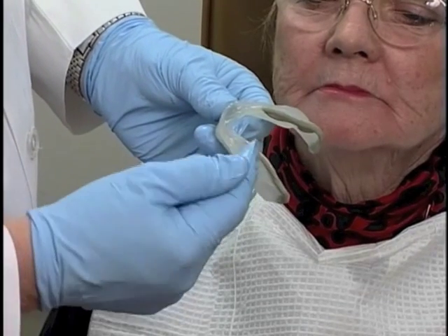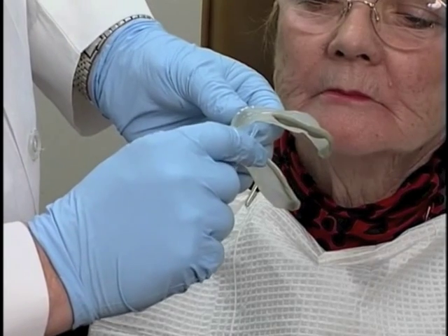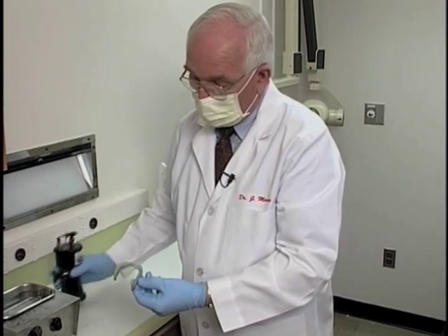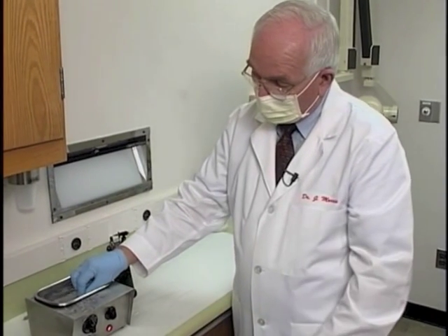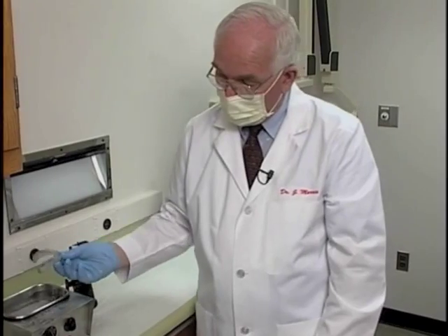The next procedure that we need to do is to finish out the lingual, the sublingual crescent area from second premolar around through second premolar. We superheat the material with the torch, then 3 to 5 seconds in the 130-degree water bath.